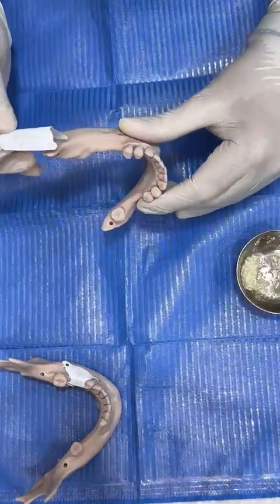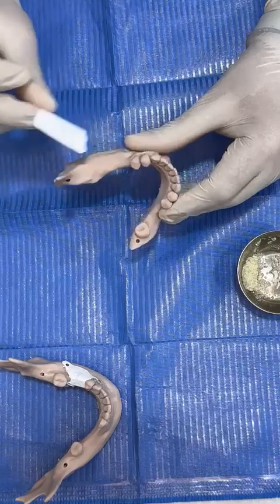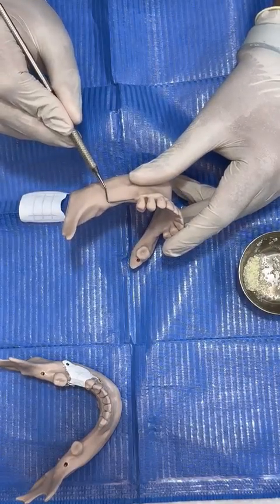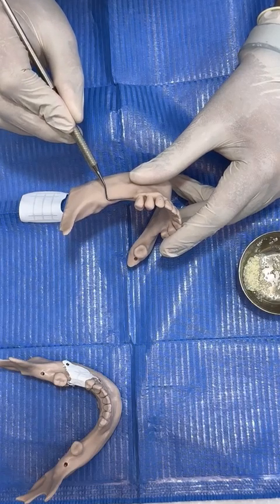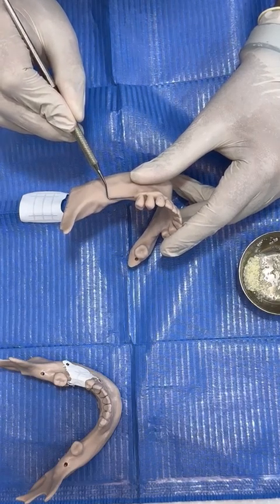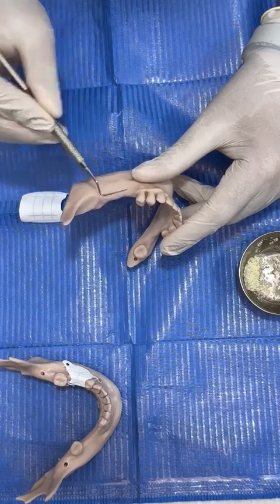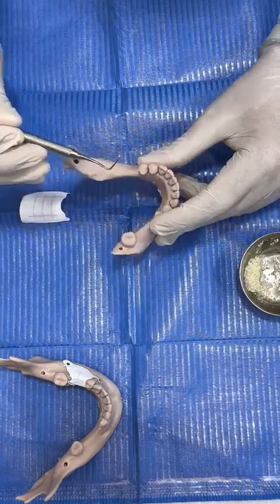Okay, now we have a partially edentulous patient, free end saddle here, and we have a defect, a combined vertical and horizontal defect. As we said in the lecture, we're going to check how deep the defect is. I can see here it's 15 millimeter in length, and almost 3 millimeter vertical defect.